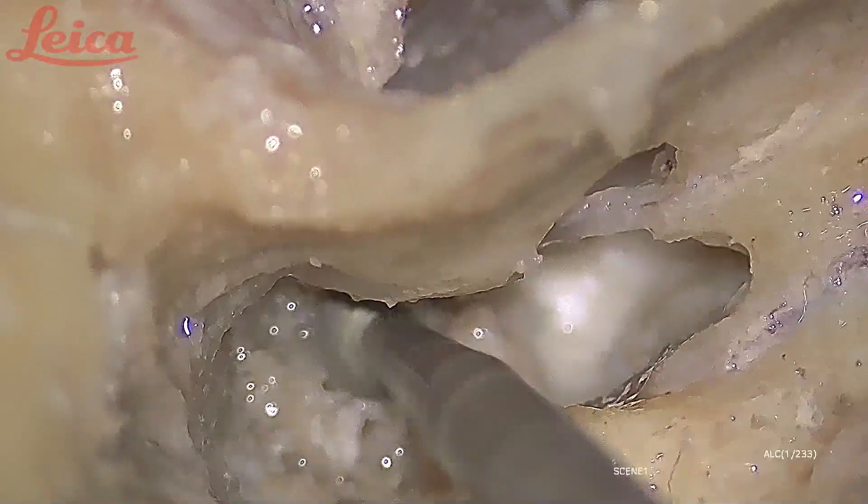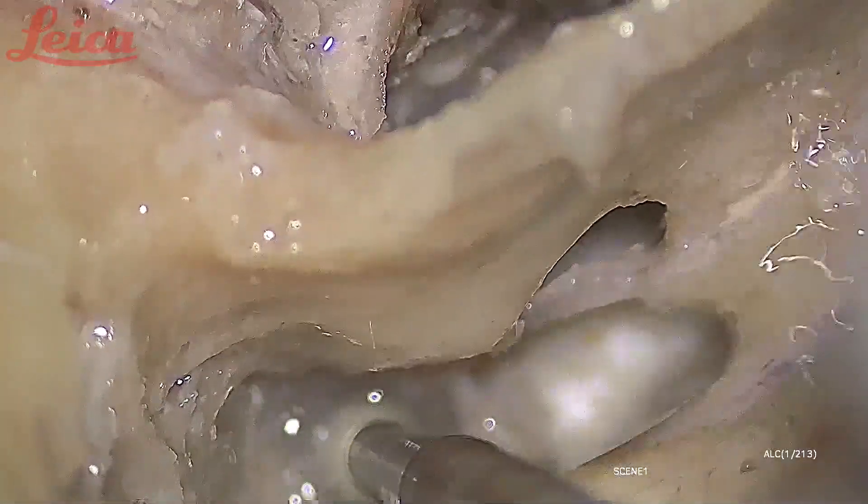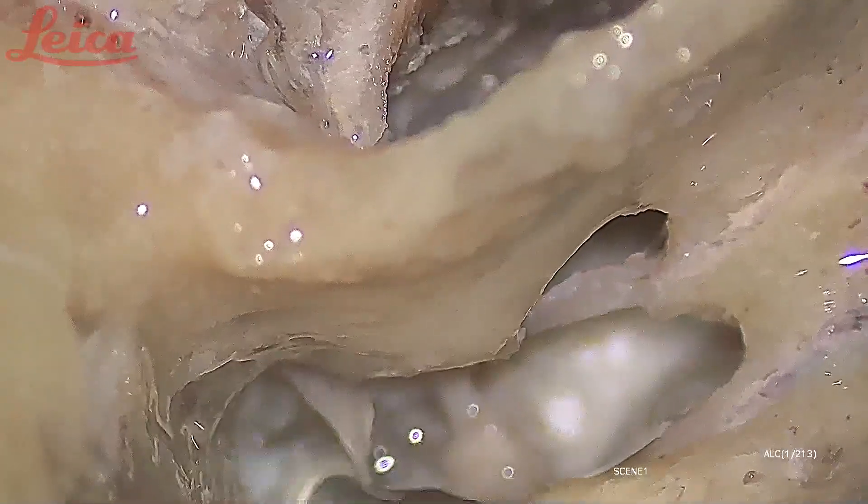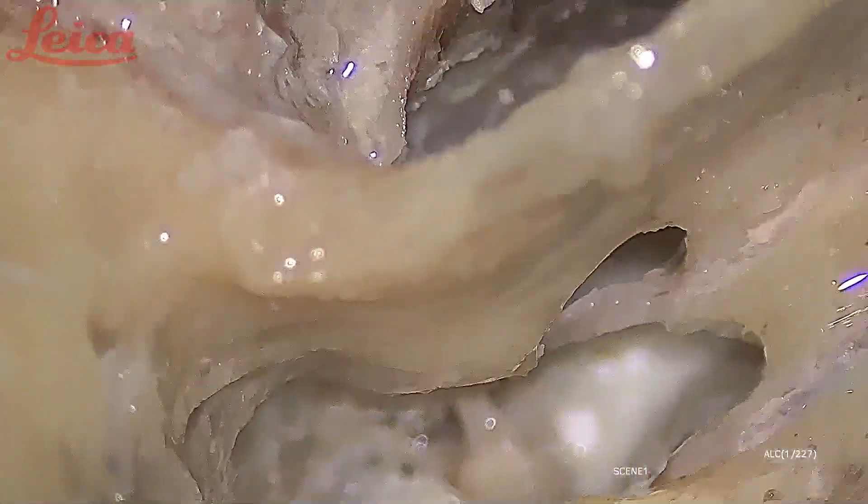For good results in facial nerve palsy secondary to longitudinal fracture of the temporal bone, it is the supra-labyrinthine cell area which has to be decompressed, and the perigeniculate ganglion area has to be decompressed. The perigeniculate ganglion area consists of the geniculate ganglion, the first genu, the greater superficial petrosal nerve, and the labyrinthine segment. In fractures we usually go through the trans-canal approach and do a trans-canal facial nerve decompression — a very simple procedure. I will try to show it if I have time, or maybe I can show the videos tomorrow.